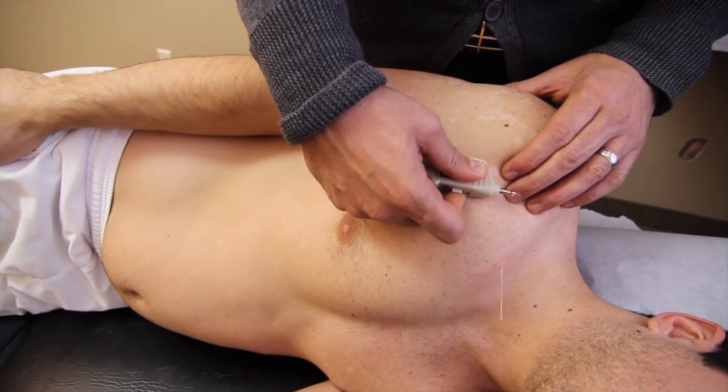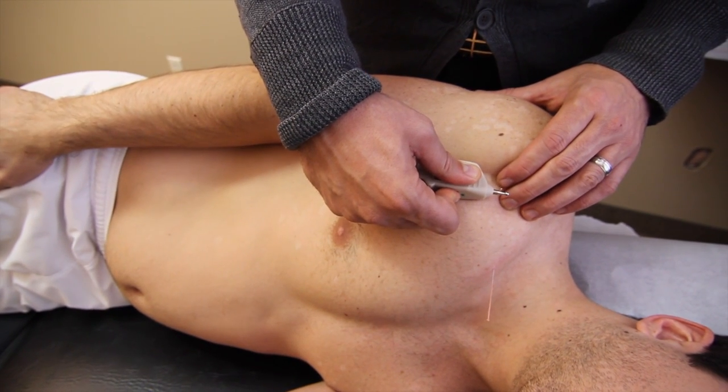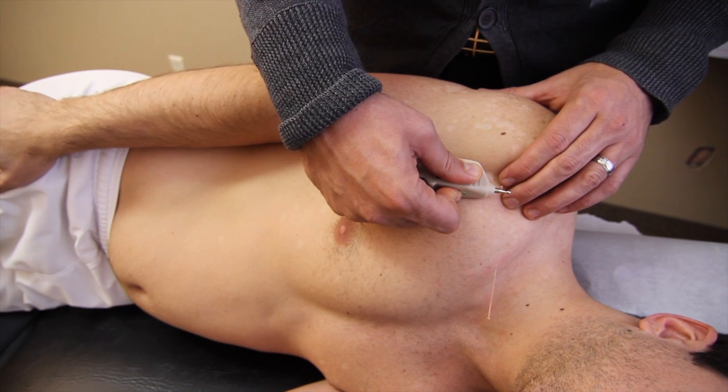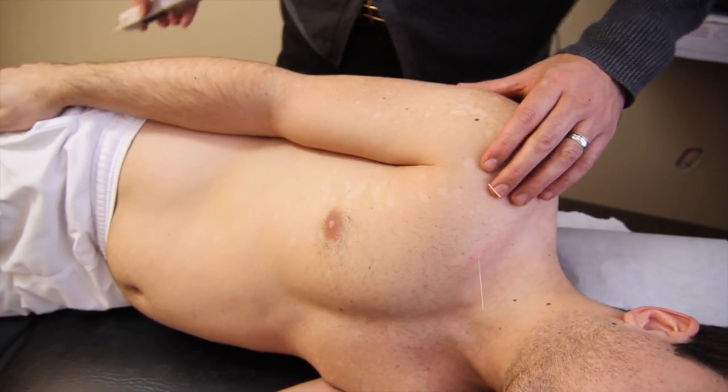This is very common when treating shoulder problems, especially this one when there's so much going on. That's the anterior deltoid.